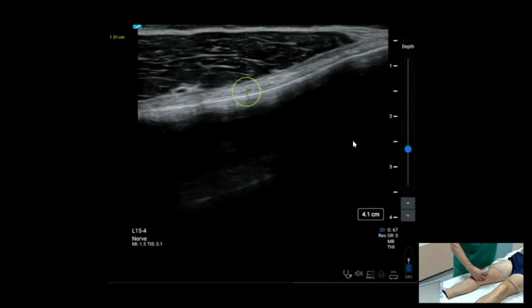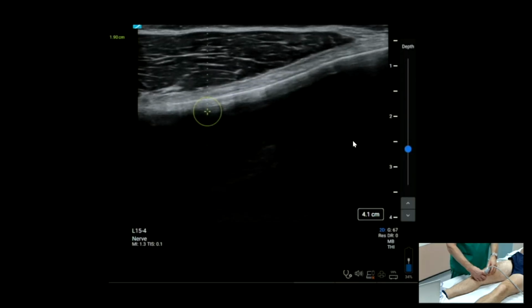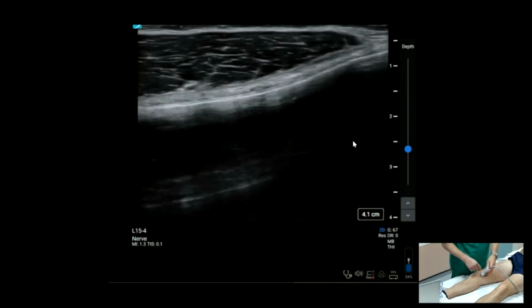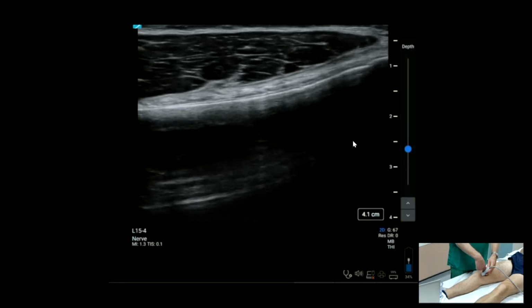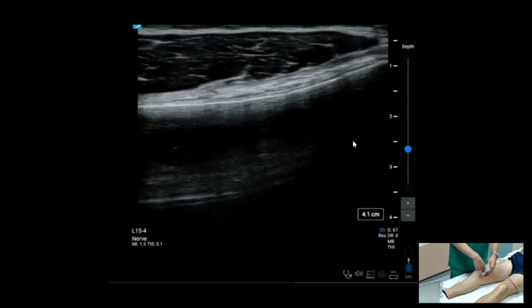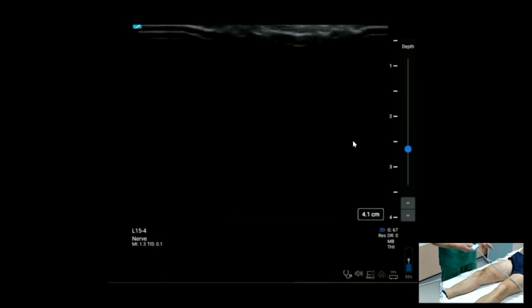And there's also a vessel here. The geniculate nerves often run with the geniculate arteries, and very conveniently on this side, we can see one right in the center of the screen. And it's an out of plane technique. So I would bring my needle in out of plane, parallel to the ultrasound probe, straight down onto the femur, aiming to hit bone, and then injecting about 3 mils or so at the point at which the femur flares up. Very, very similar on the other side.